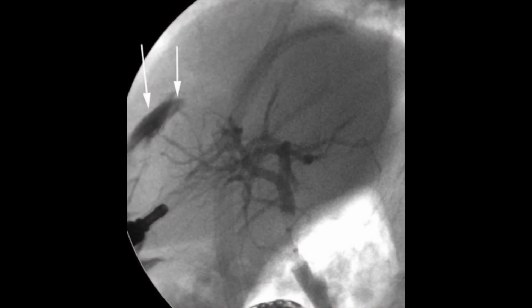In one case, during the treatment of a lesion located in the fourth segment near the hilum, a biliary fistula occurred and it was recognized during the operation. Probably, the needle produced a biliary lesion during its passage. A postoperative endoscopic procedure with a nasobiliary drainage solved the problem.